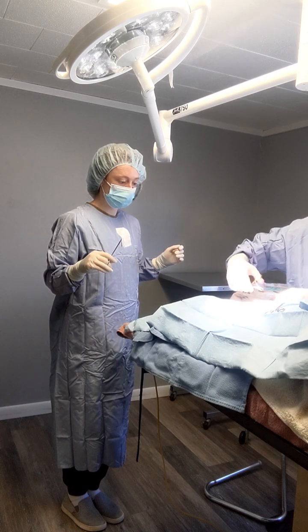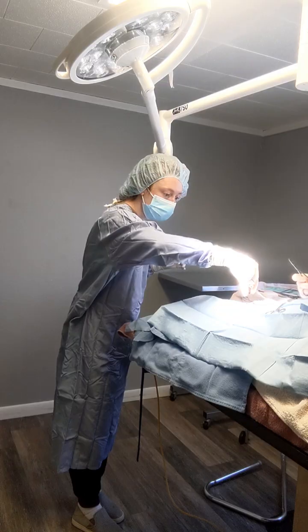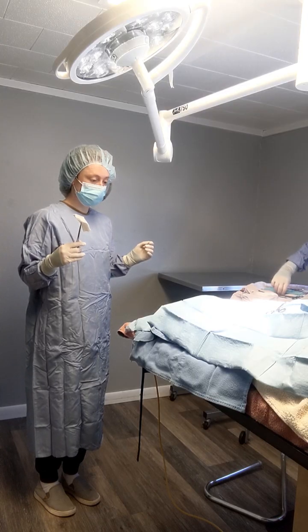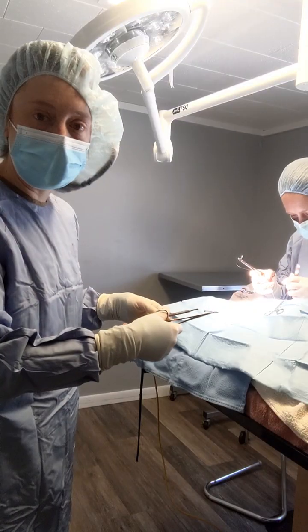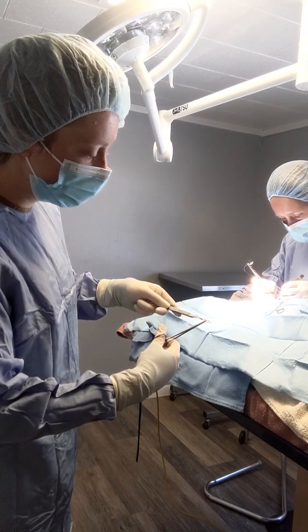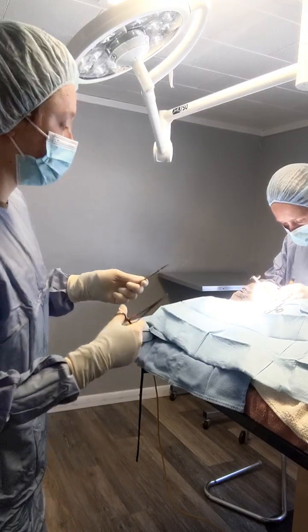Okay. I'm gonna go ahead and dab. Basically there. Nice to see. Thank you. And I'll cut it and we can dab again. Make sure we're. Yes, I saw it was normal. So to load the blade, I'm just gonna pick it up on the non-sharp edge, and then I just want to slide it into place, and it is ready.